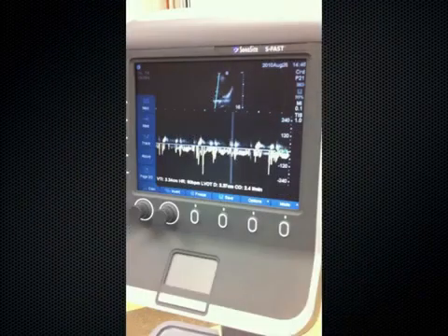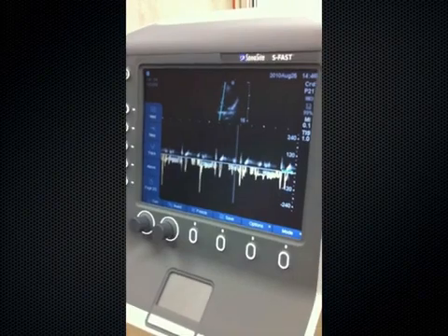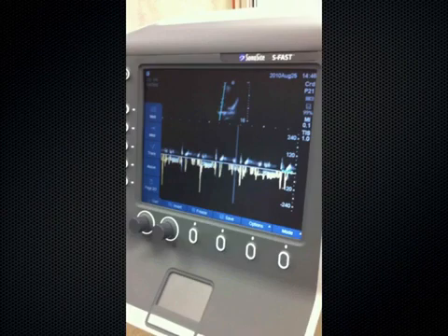Yes? So you have parabolic flow coming out, so when you do the gating, how large can you take the gate? Because depending on where you are, you're going to have completely skewed results. Yeah, there's a sampling gate that you can make wider or skinnier, and that's a good question. I've been messing with that sampling gate. What he's asking about, that little TIE fighter, you can spread out its wings, if you will, further apart or more narrow, and that changes your waveform quite a bit. So that's something we've got to mess around with. This is all brand new stuff, so I don't know the exact answer to your question.